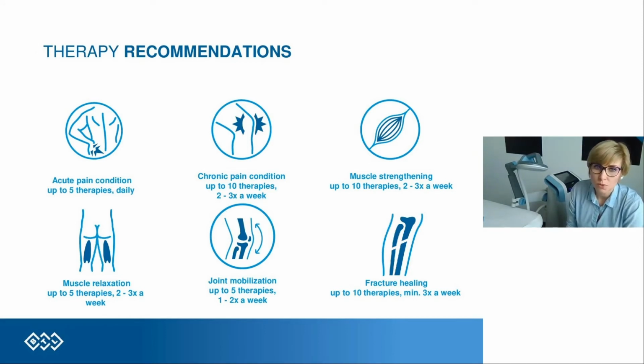So we had no time to actually recover, but we had time to increase the number of the therapies in 1 week. So it was a good opportunity to enhance the healing process in their conditions. And it was also acute ankle sprains. It was disc issues. It was some muscle fatigue, muscle overloading. So it was many diseases, many problems we had to take care of.